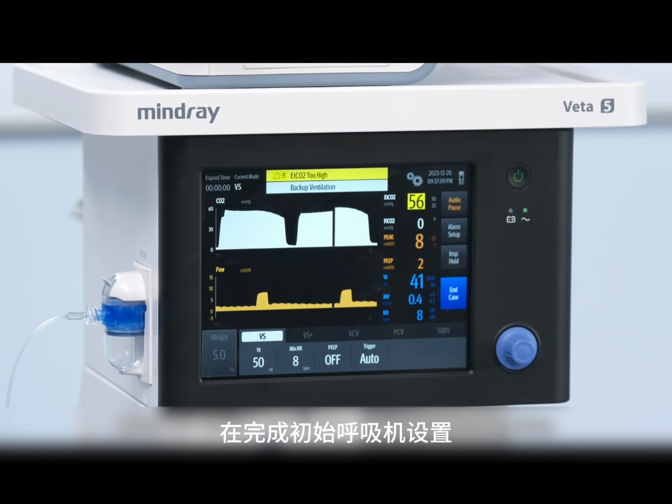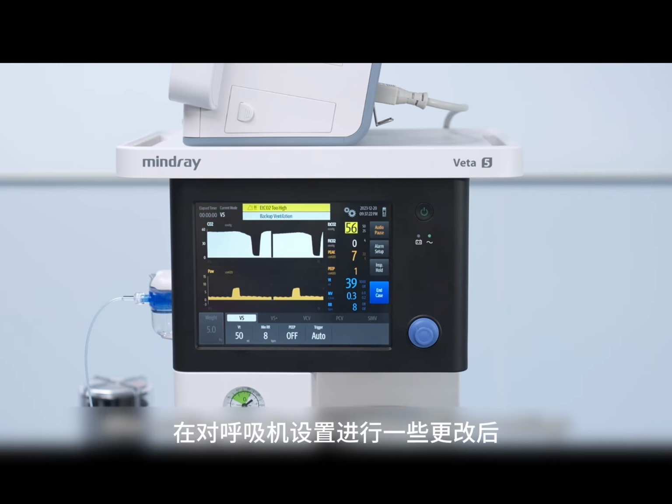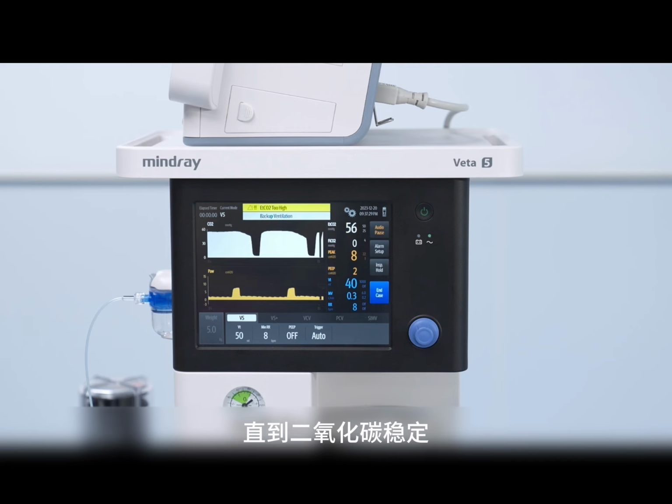After the initial ventilator settings are complete and everything seems to be fine with the patient, just watch what happens in the next 5 to 10 minutes with the end-tidal CO2 value here. After making any changes in the ventilator settings, you need to wait for a few minutes until the CO2 stabilizes before you adjust the ventilator again.